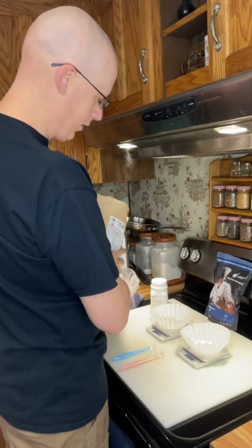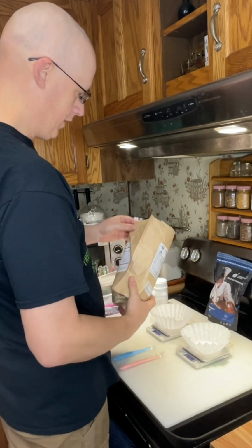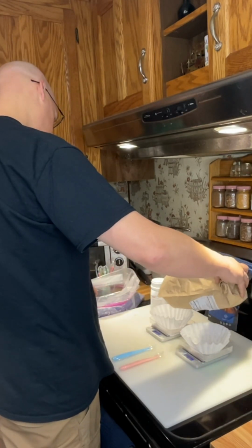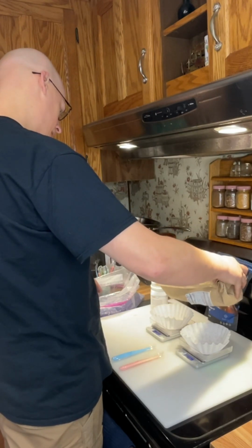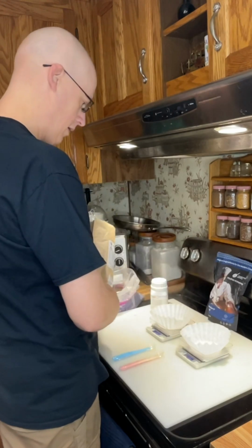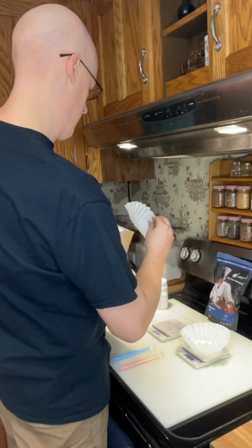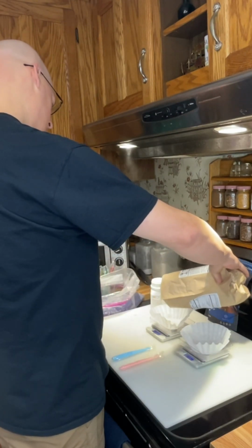So we're going to do two recipes here right now. We're going to do a water agar, which is just agar and water. So real simple. We're going to go ahead and throw in this batch. I think we're going with about 8.9 grams. If I don't put way too much in there, that is. Let's try that again. We want about 8.9 grams.